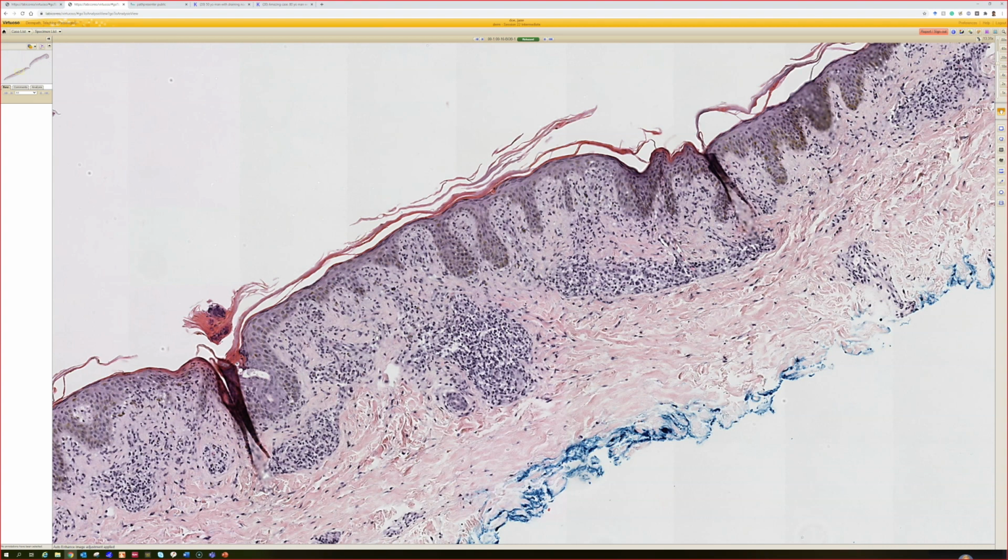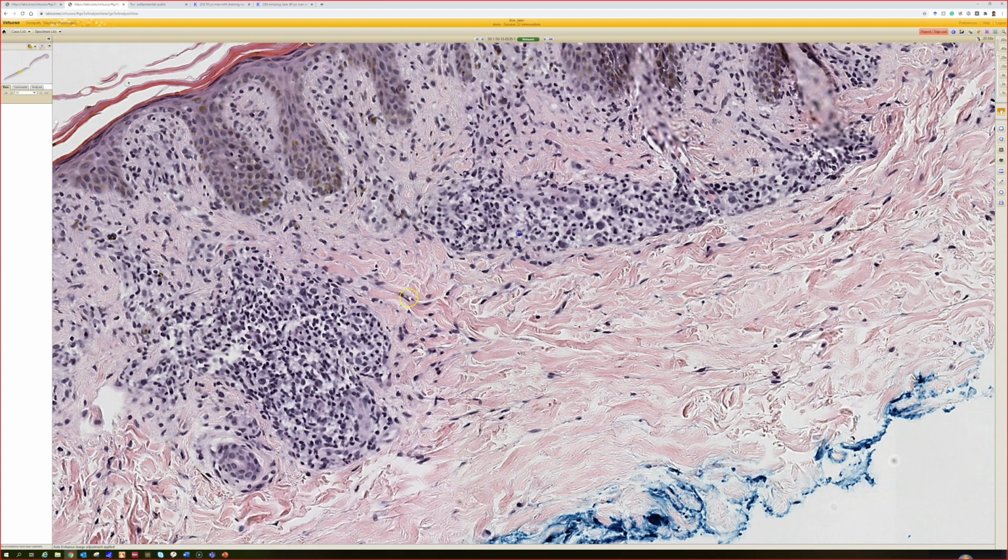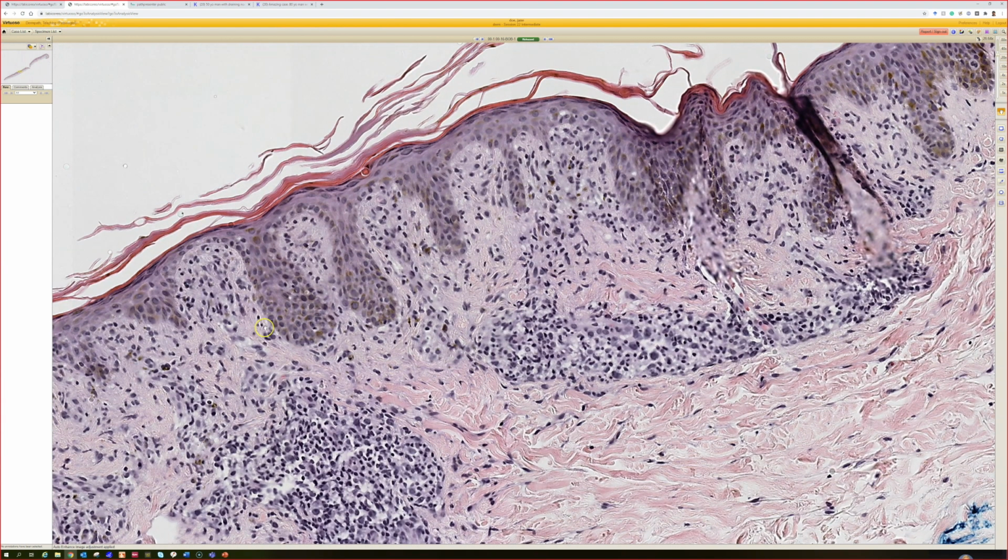But some of those times I was really not suspecting syphilis. And because this is a disease that is bad if it's left untreated, it's easily treated, it's sexually transmitted, there's a whole bunch of reasons that we really, really want to try to avoid missing this. So whenever I see plasma cells around vessels, I think of syphilis. Whenever I see a lichenoid kind of band, especially, a normal lichenoid or vacuolar interface should have a lot of dying keratinocytes.